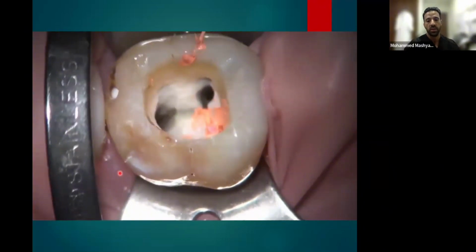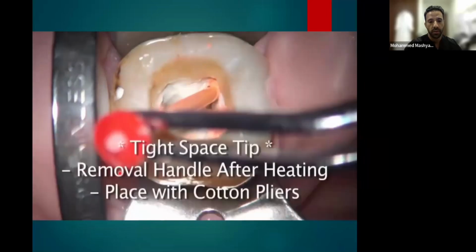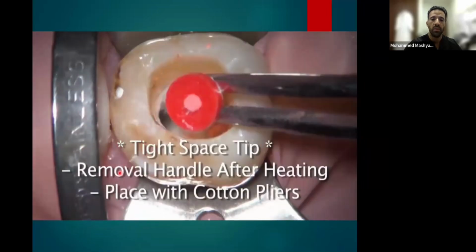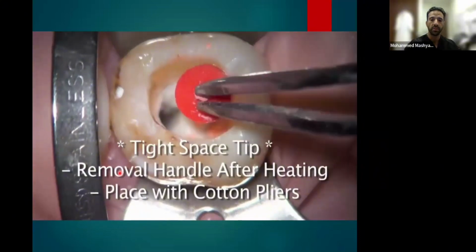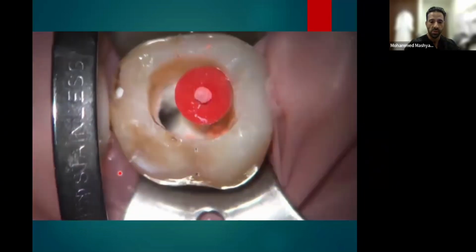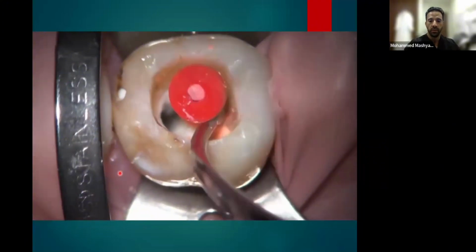And again, now you can see this one's being placed with the cotton pliers, facilitating access. And that is my method of choice. So when it comes out of the oven, I'll grab it with the cotton pliers, break the handle, and place it this way. It provides just that extra few millimeters of access so the handle isn't getting in the way. We can see that the carrier is being severed with a sharp spoon.